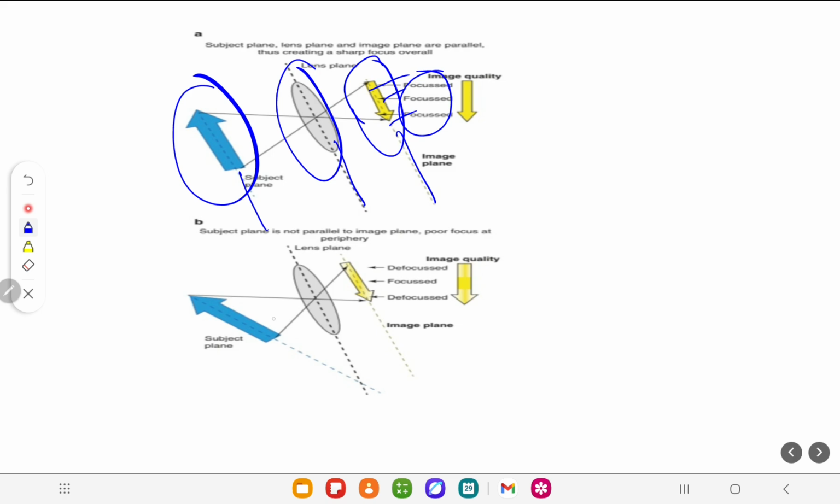We understand. Whenever we change the object plane or subject plane, what happens? The three planes do not meet at one point, so the Scheimpflug principle is not there. Then what happens? See, it is defocused, the center is focused and the tip is also defocused. You can use your mobile phone and see if it happens or not. It happens.